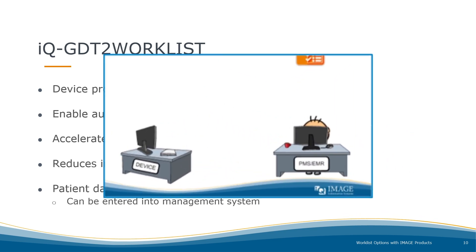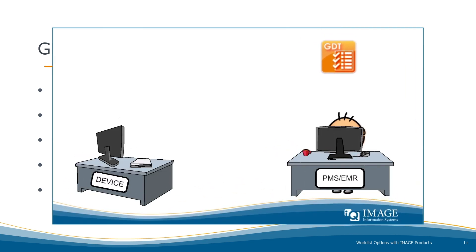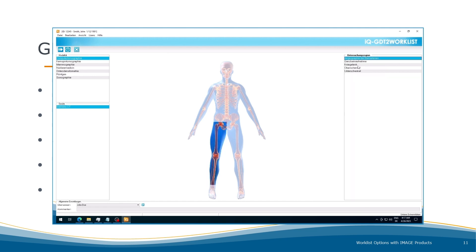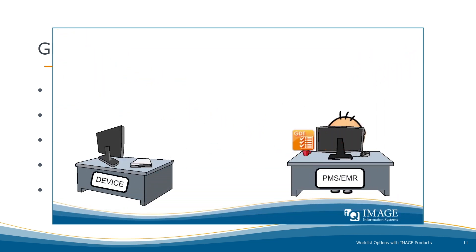Bob enters the patient data into his EMR, which can supply a GDT file containing patient data but no study data. Using IQ-GDT2 Worklist, he adds the missing data by entering the modality and body region. A table of possible examinations appears. Bob selects a valid examination, and GDT2 Worklist automatically sends the completed dataset to the device.